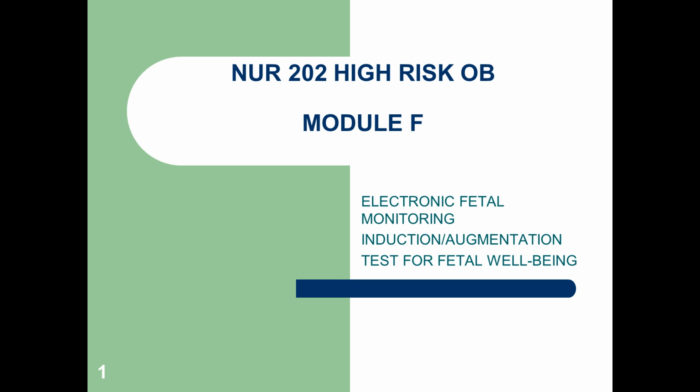So let's get started. FHR, fetal heart rate monitoring, or EFM, electronic fetal monitoring, you'll see that written simultaneously, is integral to fetal surveillance. That means we're watching over the baby. Auscultation of the fetal heart rate, or the fetal heart tones, FHR, FHT, has been and continues to be a standard component of each prenatal visit.